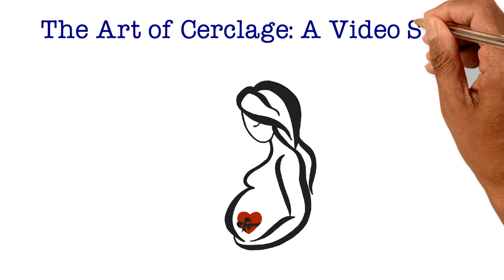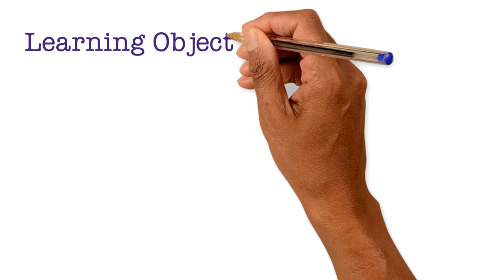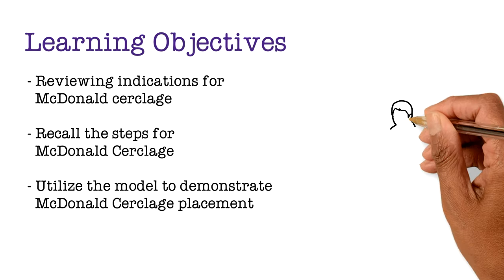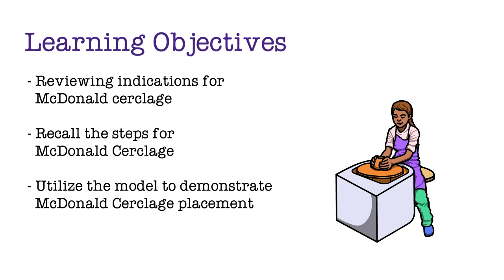Welcome back to the Art of Cerclage. In this video, we will place a McDonald's cerclage on a model. The learning objectives include reviewing the indications for and the steps to complete a McDonald's cerclage, and utilizing our model to demonstrate the technique.